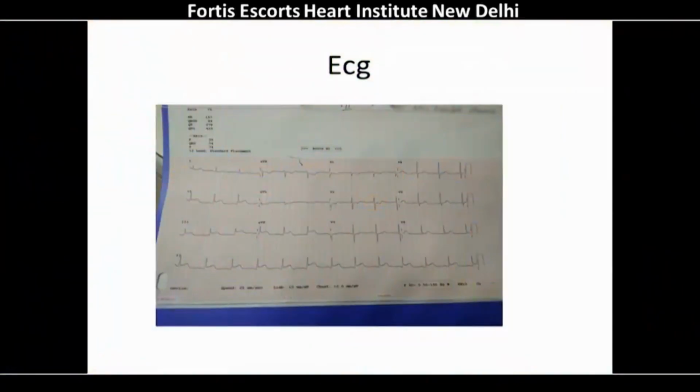You see the clear ST elevation in 2, 3 and AVF.